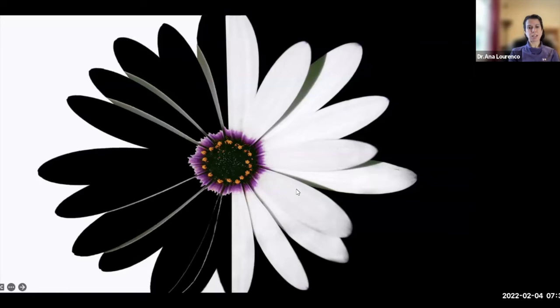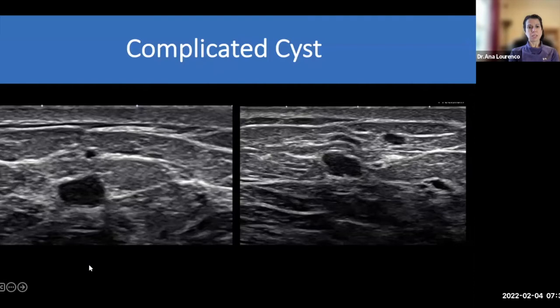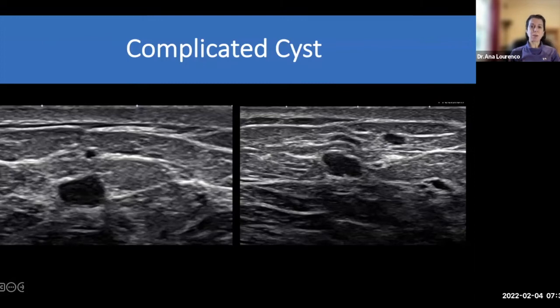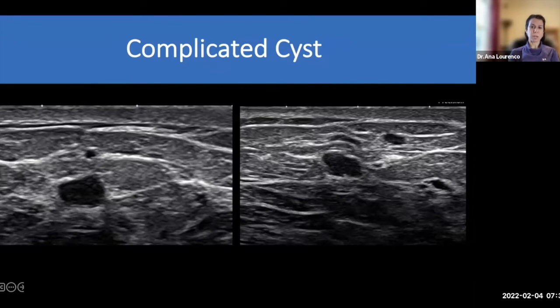I promised to contrast complex cystic and solid with complicated cysts. A complicated cyst has homogeneous internal echoes, parallel orientation, no discretely solid portion, and there may be adjacent cysts in the neighboring tissue. Complex solid and cystic masses should lead you to biopsy. A complicated cyst encountered during callback for a new or changing mammogram finding is often BIRADS-3 with six-month follow-up. Encountered incidentally on screening ultrasound alongside bilateral simple and complicated cysts, it's a benign BIRADS-2 finding. Complicated is not interchangeable with complex solid and cystic.